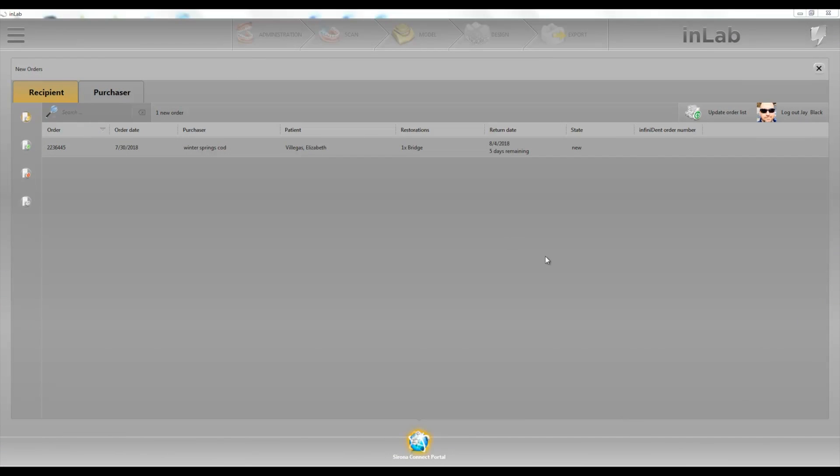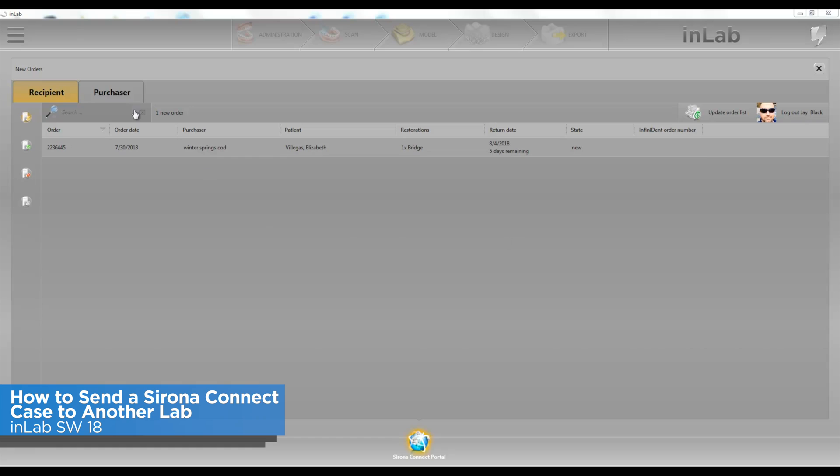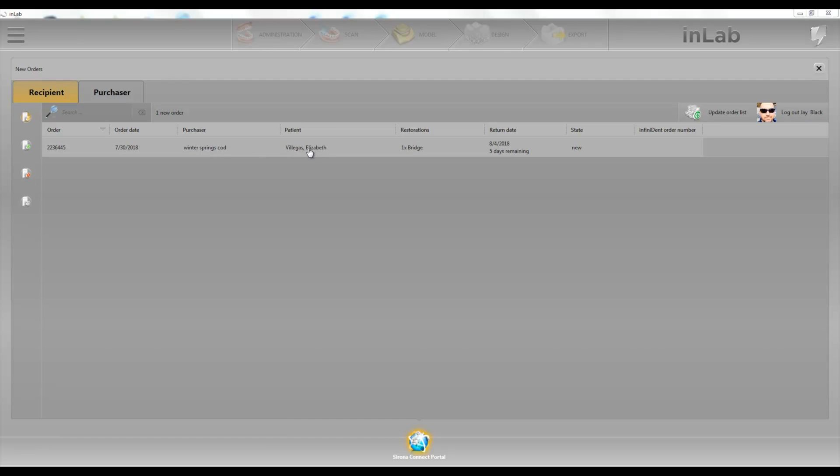Hey, this is Jay Black with Tekken2. In this video we're going to go over how to send a case that we got through Connect to another lab. So this case I ended up sending to myself from my own Omnicam just to show how it works.